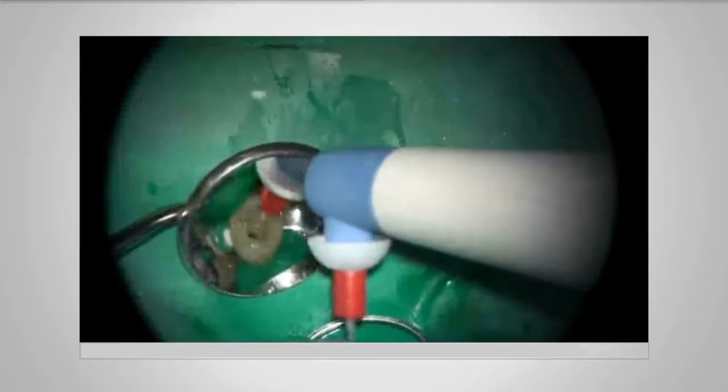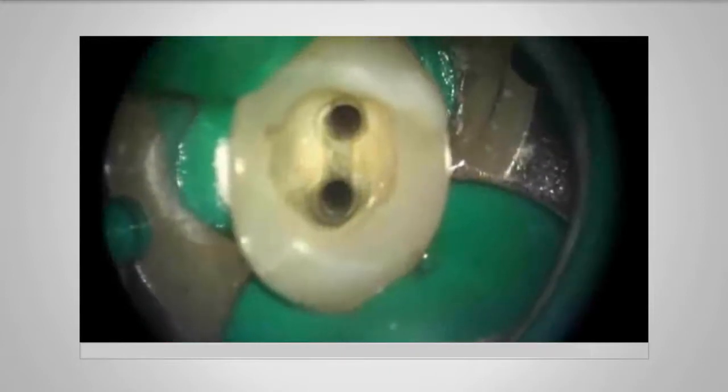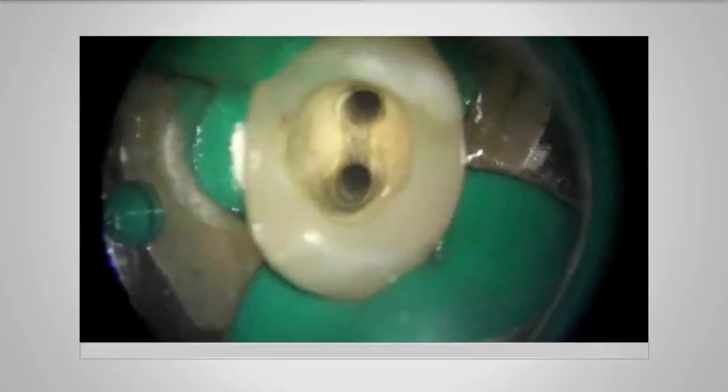Okay, we've had a couple of questions. One is, what do you use to seal rubber dam? Well, if you look at this case, the tooth is rotated, and so the rubber dam clamp doesn't fit perfectly onto the tooth because this is buccal and palatal, and this material here is called Oroseal caulking, which is great to seal the rubber dam. If I'm doing root treatment on a bridge, then I'll pipe the caulking around the bridge and over the pontic before putting the rubber dam on, and then that will seat onto the caulking material.